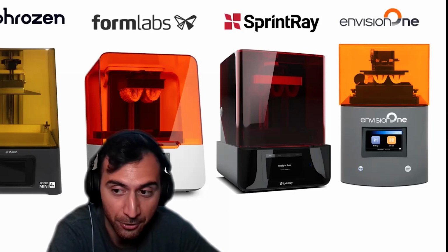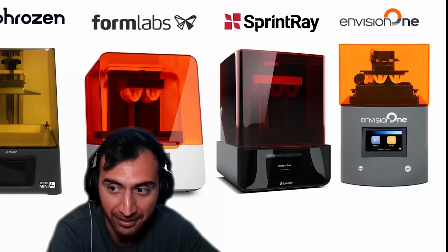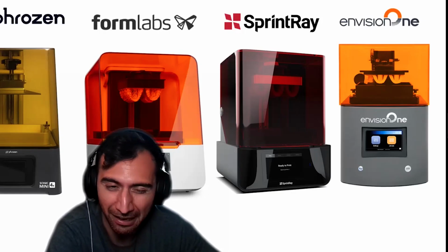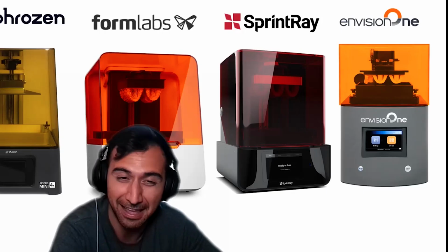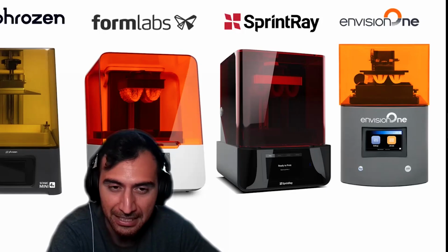I will tell you, I do not know if there's enough of a benefit except for bigger platforms to print on. Like the build plates are bigger sometimes, and they're maybe a pinch faster. But I'll be honest, it's not that much faster, and the accuracy isn't that much greater in a dental environment to matter.